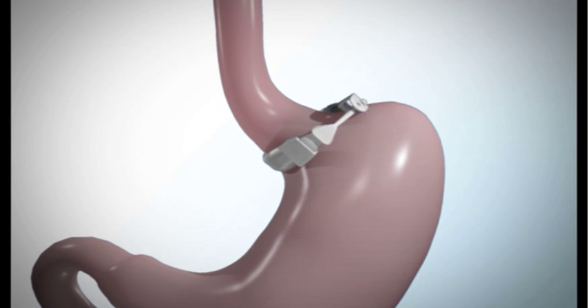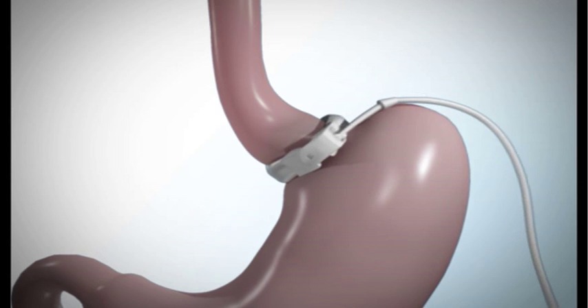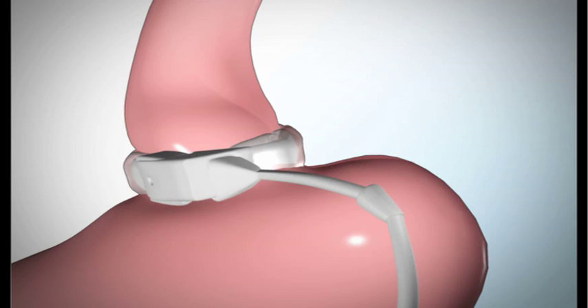Your surgeon will then lock the band into position by threading one end of the tube through the hole on the other end of the band. Your surgeon will secure the band by stitching the part of the stomach that is directly below the band, called the fundus, to the part of the stomach just above the band. These permanent stitches prevent the band from slipping.